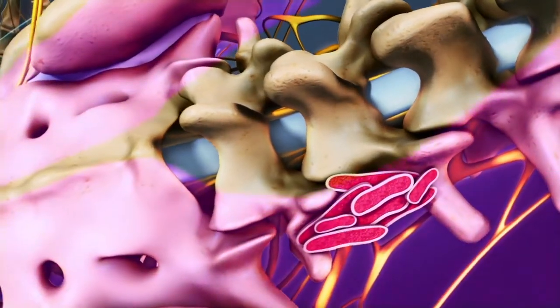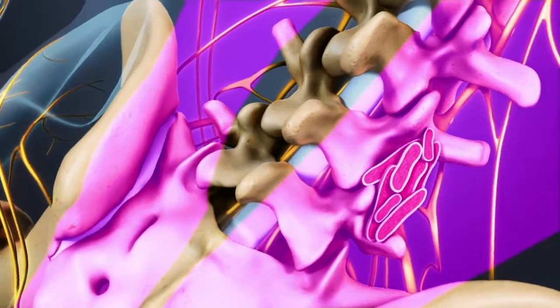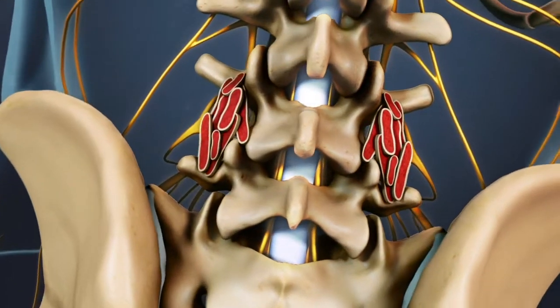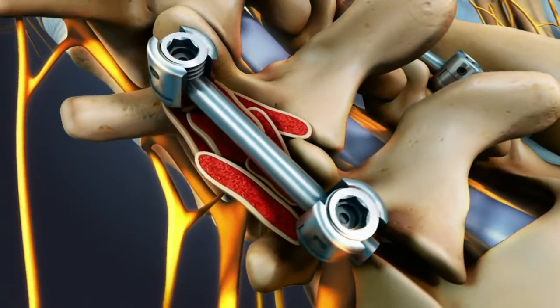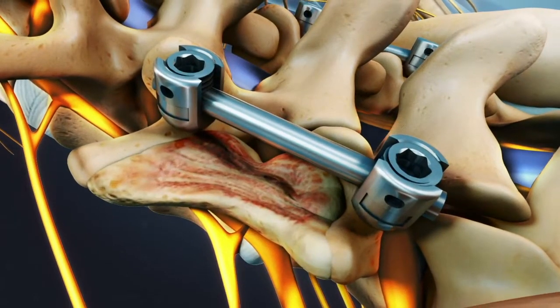The surgeon then moves the muscles back down over the graft, generating tension that will hold it in place as the body heals. The process is repeated on the other side of the spine so that both sides can fuse. The surgeon may also use spinal instrumentation, such as pedicle screws and rods, to provide additional stability while the bone fusion is healing together.